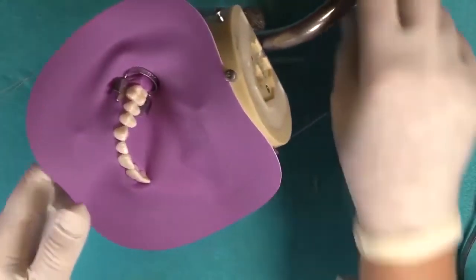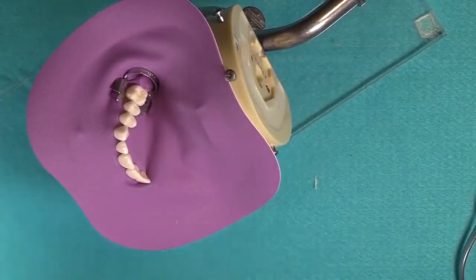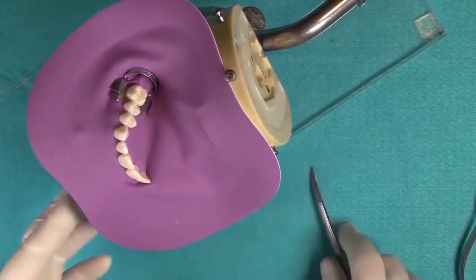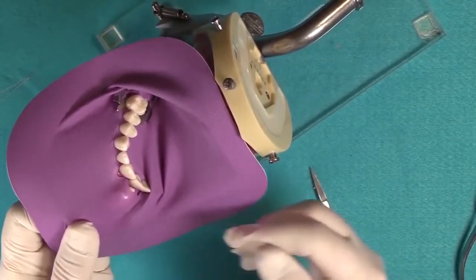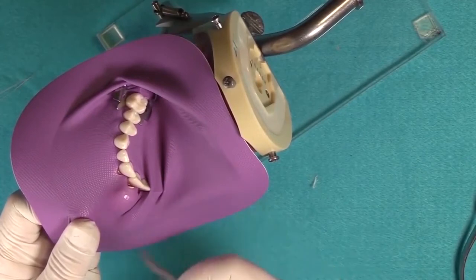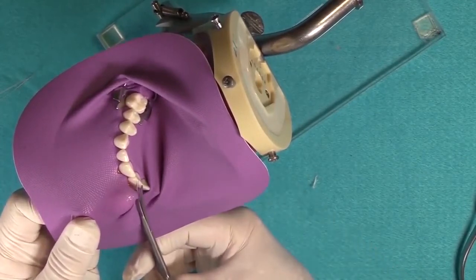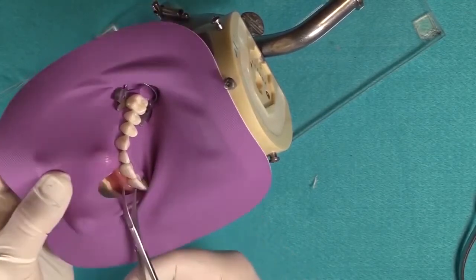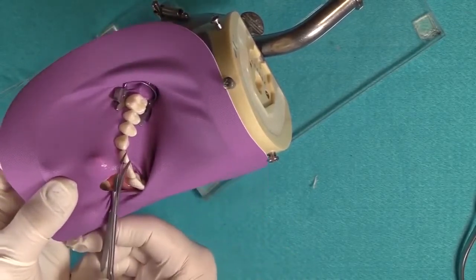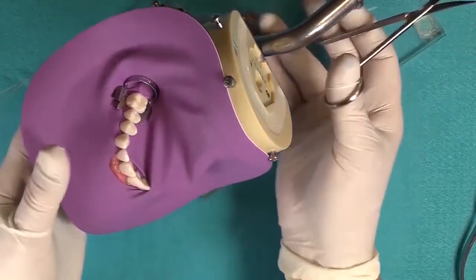You want to cut the interseptal dam, that's the material between the teeth. You need to protect the patient's lip. So I put my index finger here in the vestibule. My scissor, which is curved, is going to be pointed away from the tissues towards the incisal edges. And when you cut, make sure the entire blade encompasses the interseptal material.